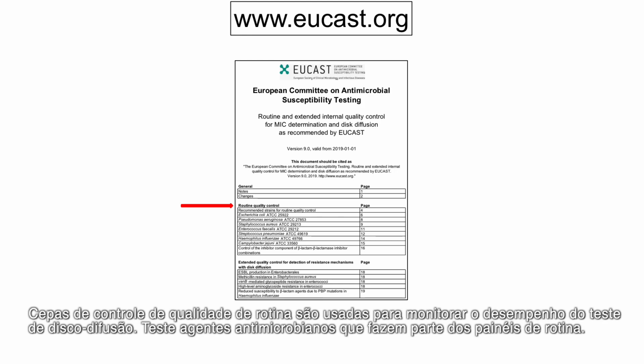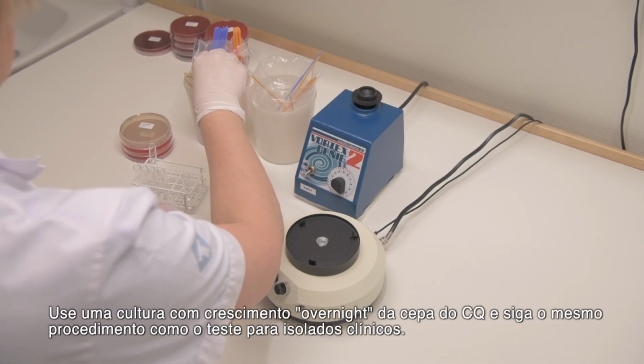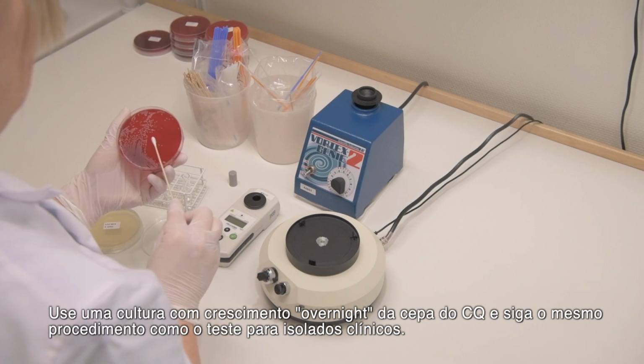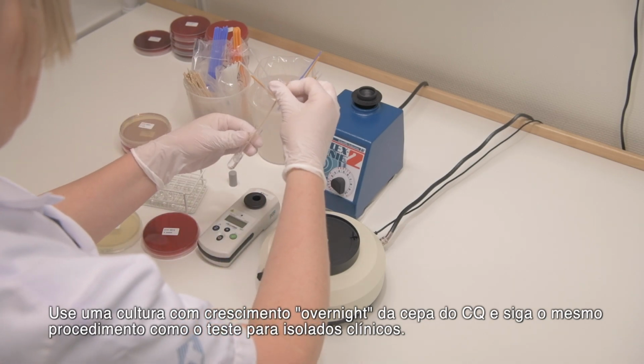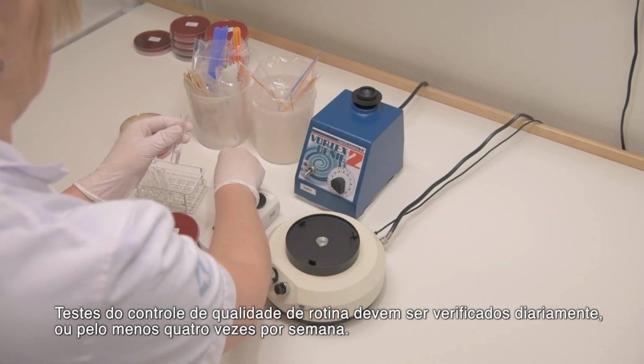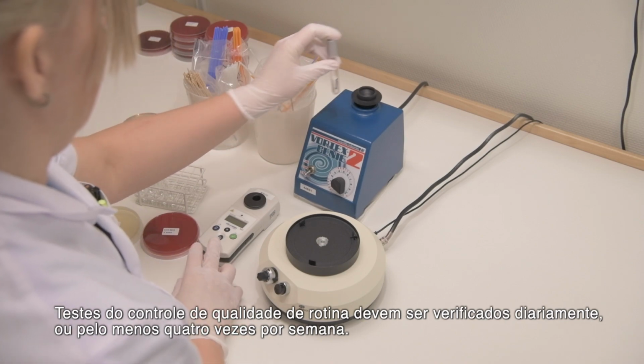Routine quality control strains are used to monitor the performance of the disc diffusion test. Test antimicrobial agents which are part of routine panels. Use an overnight culture of the QC strain and follow the same testing procedure as for clinical isolates. Routine quality control tests should be set up and checked daily or at least 4 times a week.